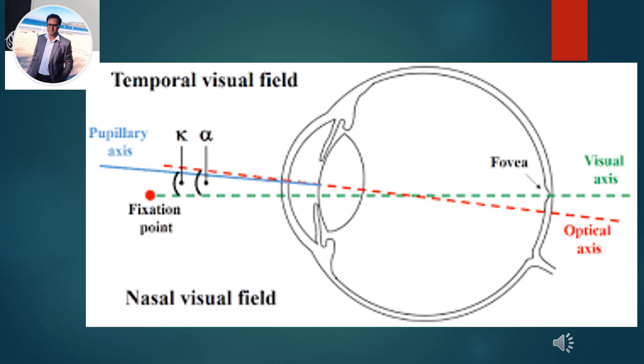Now, your horizontal white to white is basically where the bag is at the center, roughly, if the lens is not subluxated, if it doesn't have a zonular dehiscence, if the zonules are not weak. And now in this bag you are going to put the lens, so keeping the other factors aside, hopefully the lens will be at the center of the bag. So the line that goes through the center of the lens is basically now the optical axis, which is the center of the bag, and it reaches the center of the white to white, keeping the other factors aside, like the patient doesn't have a zonular dehiscence or zonulopathy. So any difference between the visual axis and the optical axis in this case is the angle alpha.